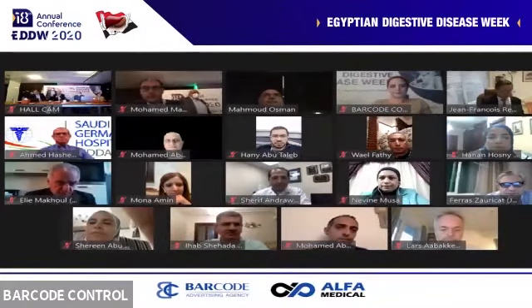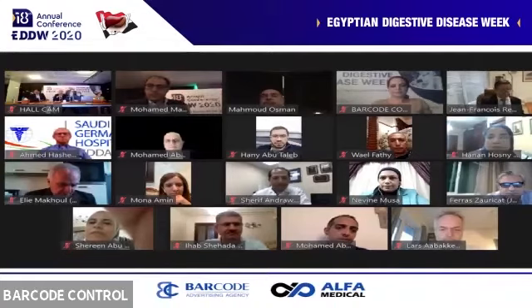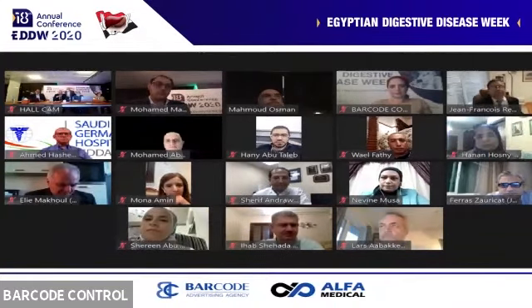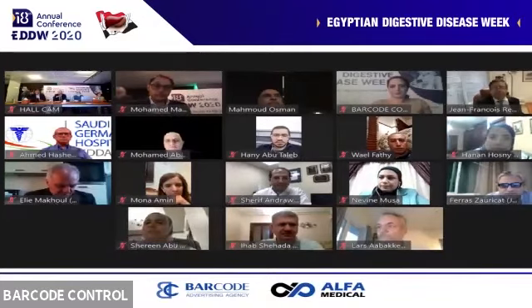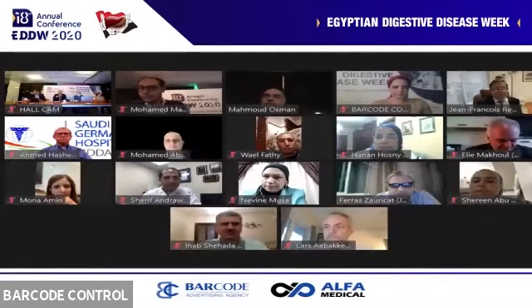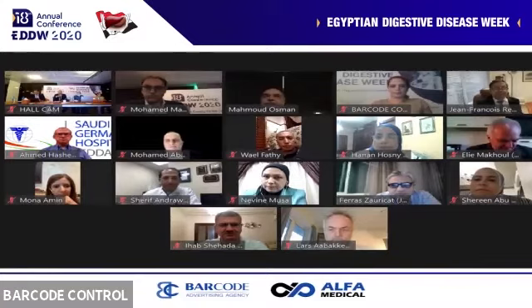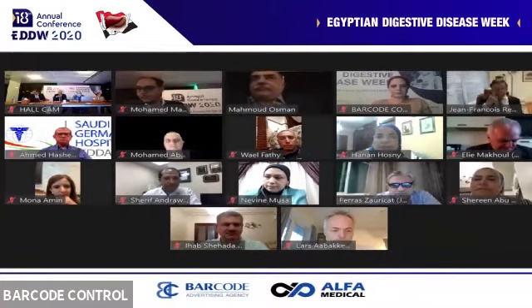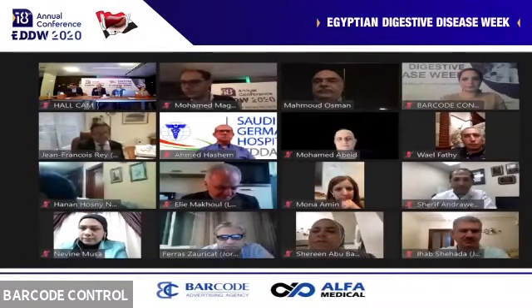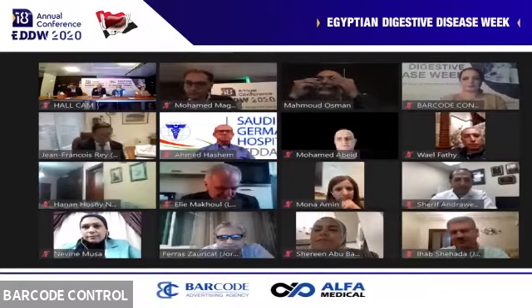Good evening, everyone. Pleasure moderating this session. It's one of the most favorite and exciting topics nowadays, which is third space endoscopy. Perhaps a few years ago, we talked about it as if it was something futuristic or experimental. But as we will see now from our presenters, it has now become a daily technique that we've been using in different problems.